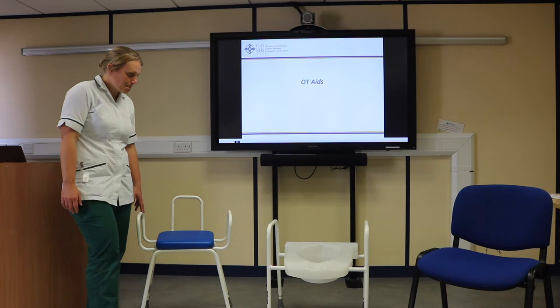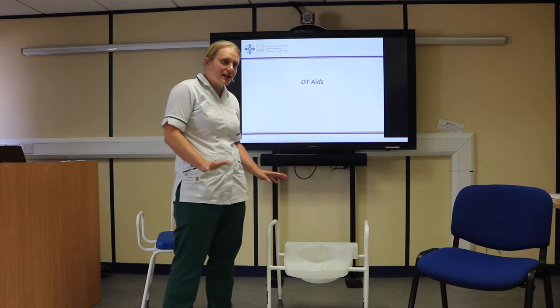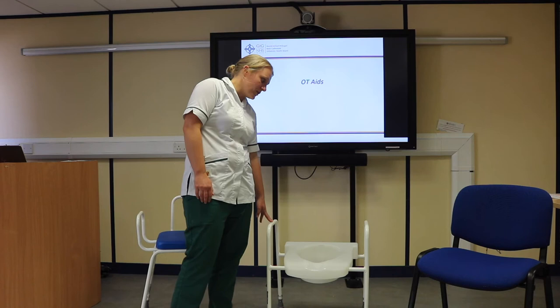Here we've got a raised toilet seat and frame. These can be adjusted to the right height for each individual person, and means that the toilet can be high enough for you, as most toilets following a hip replacement are too low.